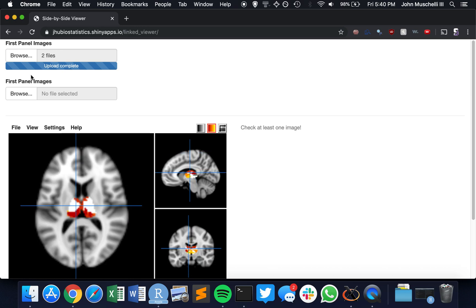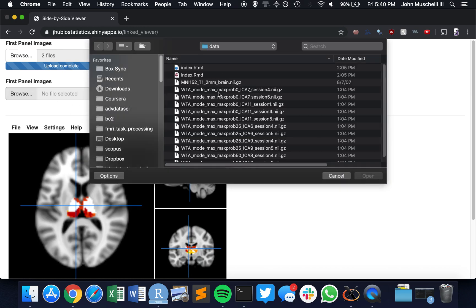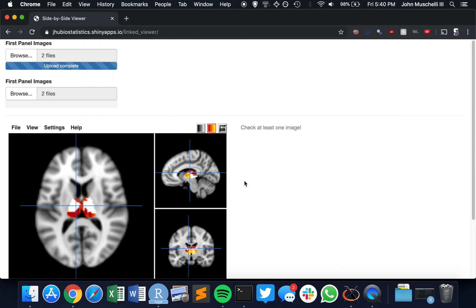We can scroll through this, do whatever we want. Similarly, we can do the same thing again. I'm going to put the image on there and then the overlay. These are two different little sessions.